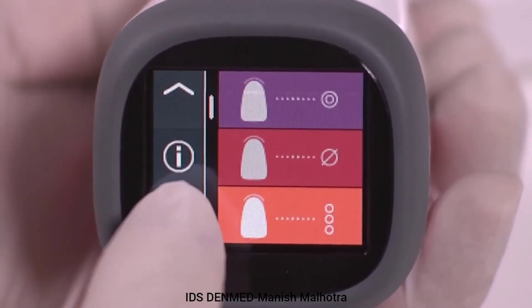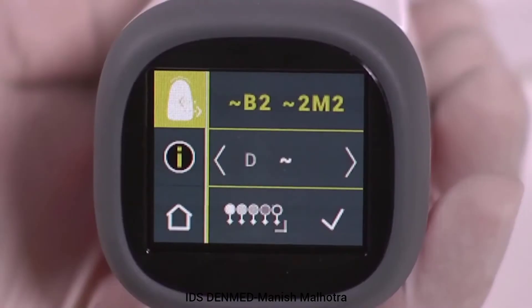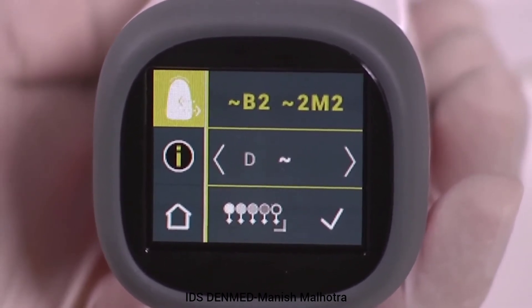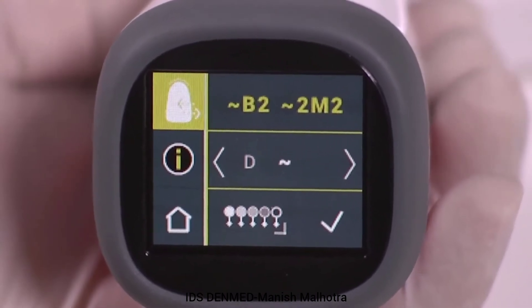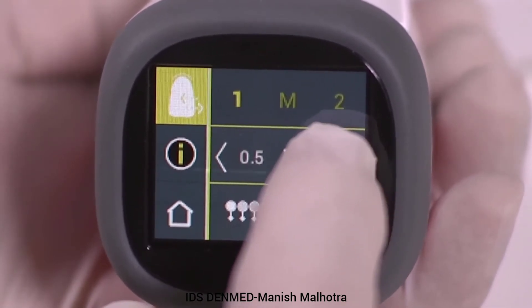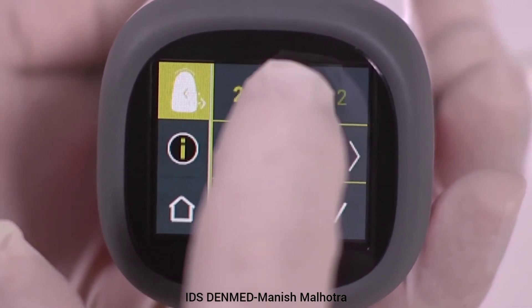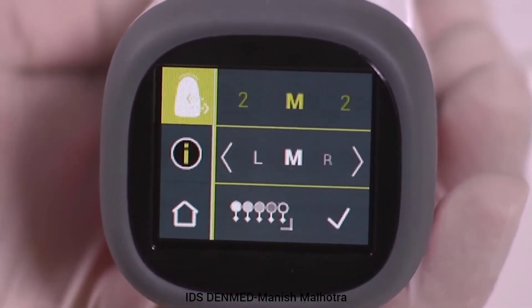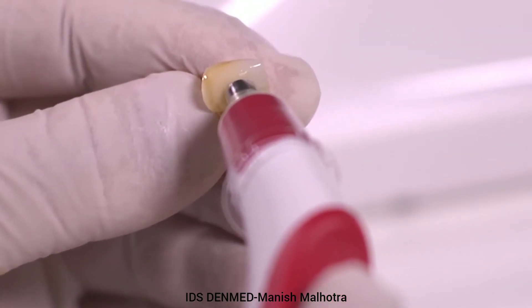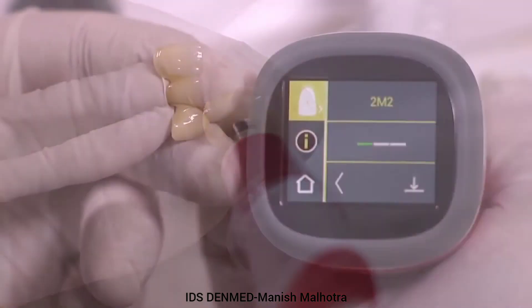Go to the ceramic restoration measurement screen and select the ceramic shade verification tab at the top of the screen. This function is used to verify a known Vita 3D Master and/or Vita classical shade of a ceramic restoration. It can also be used to create and quality control against a user standard. Step 1: Select the shade to be verified by using the arrows to scroll and select either a Vita 3D Master or Vita classical shade. In this example, we are verifying the Vita 3D Master 2M2 shade against a ceramic restoration. Step 2: Place the measuring tip on the area with the most color, approximately the middle third of the restoration. Step 3: Push the measurement button once to verify shade.